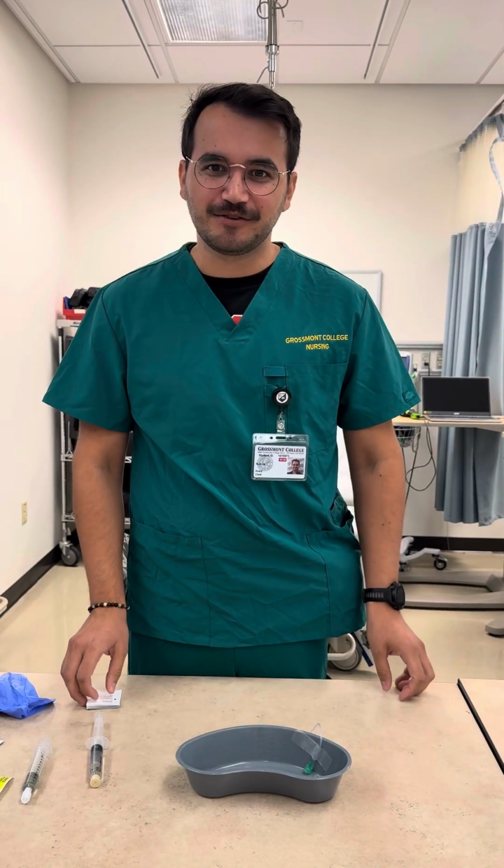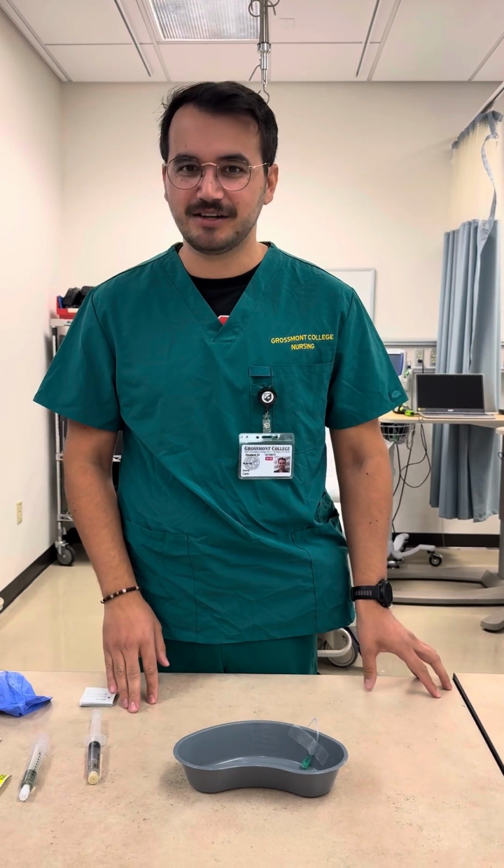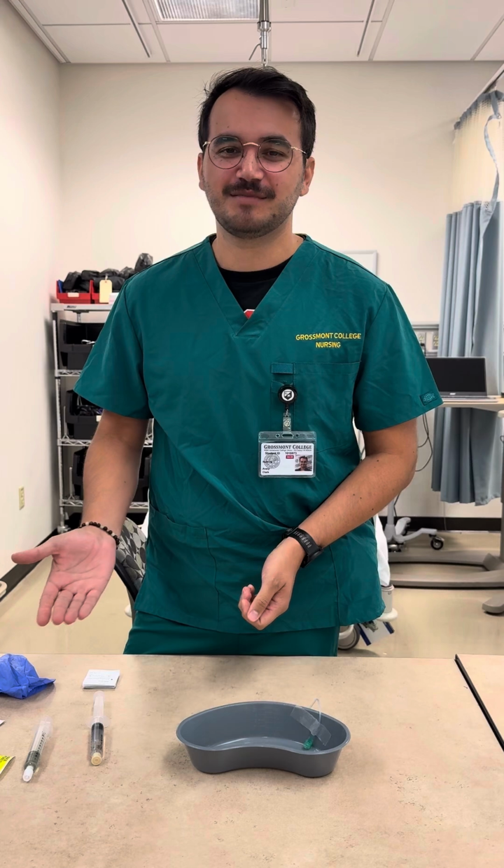Hi, my name is Avery Clark, and I am a nursing student at Grossmont College, and I am here to demonstrate the proper administration of an intravenous medication.